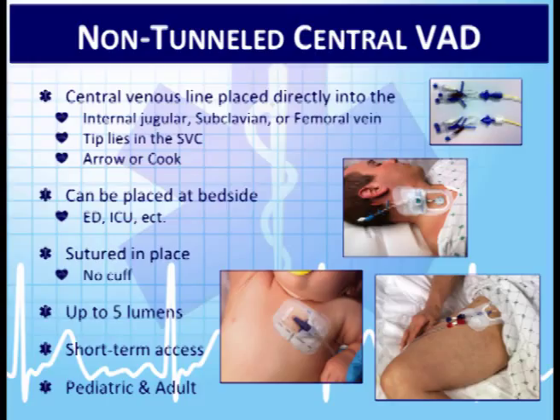It can be placed at the bedside, in the emergency department, ICU, wherever they need it. Sutured in place. There's no cuff holding it underneath the skin. No antibiotic impregnated underneath the skin. So that's why it's important to have that Tegaderm dressing with the chlorhexidine impregnated in it, or to have that biopatch around the device at the insertion point.